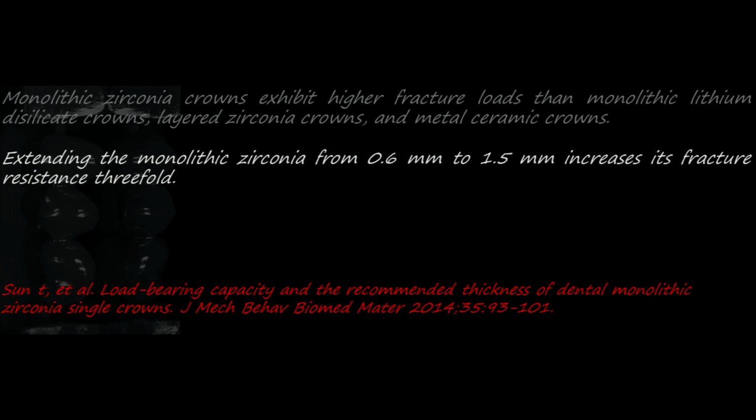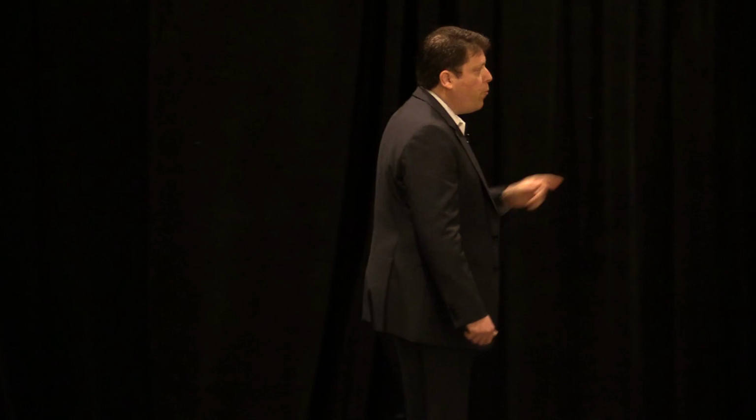Also, if you increase the thickness of the material from 0.6 millimeters to 1.5 millimeters, its fracture resistance goes up threefold. And the bottom line, which was really exciting for me as a clinician, was, wow, the fracture resistance of monolithic zirconia crowns with a thickness of 1 millimeter at the occlusal aspect is similar to what we see with PFM. So this is really the first time that a statement such as that is made.